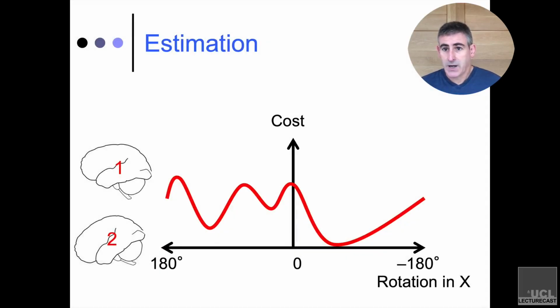Okay, so with that in mind, you could imagine doing this in a sort of painfully computationally intensive kind of way, where you say, look, I have these two images, and these are the images that I'm given, a reference and my volume. What if I change that volume by rotating it in X 10 degrees, 20 degrees, 30 degrees, or negative 10 degrees, right? In which case I could compute a cost function for each of those different images, and I could just see which one was the lowest cost. And that's what I'm sort of showing here.